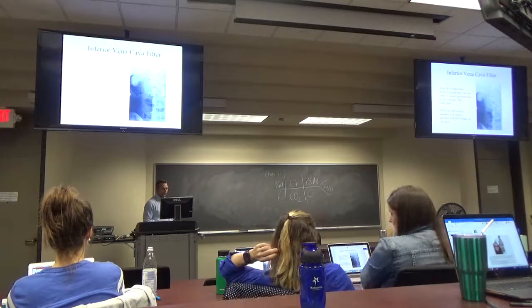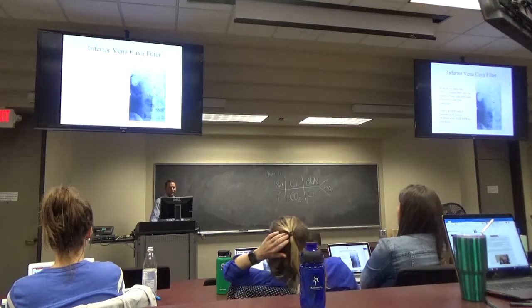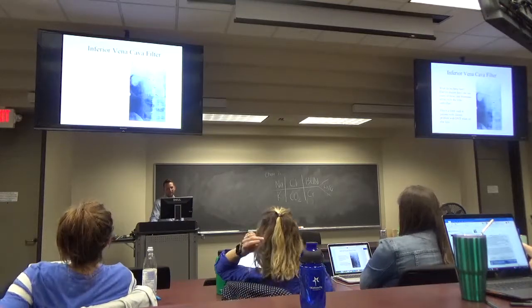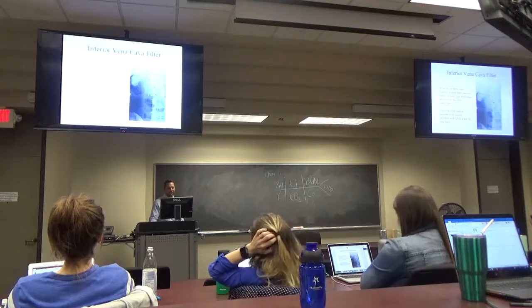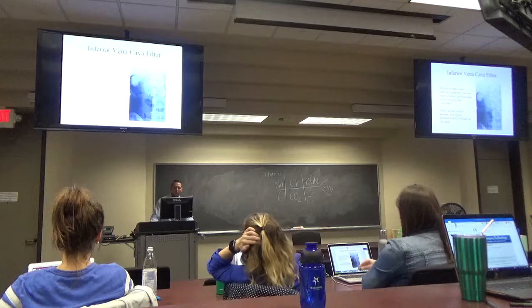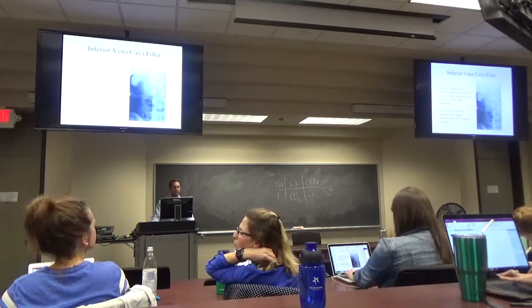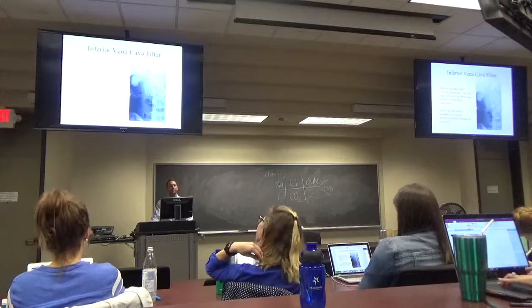So this right here is an IVC filter. I'm sure you guys have heard all the commercials about the IVC filter placement, you know, if you got an IVC filter, come sue this person as soon as possible. So these are put in as a last resort. Our IR docs don't even really like to put these in that much, because they have problems with them, they have problems getting them out.